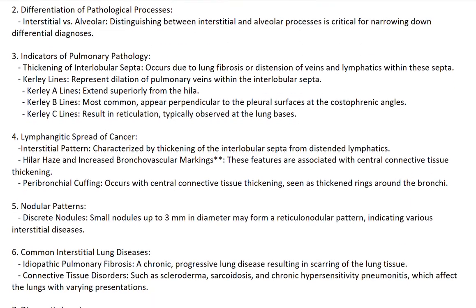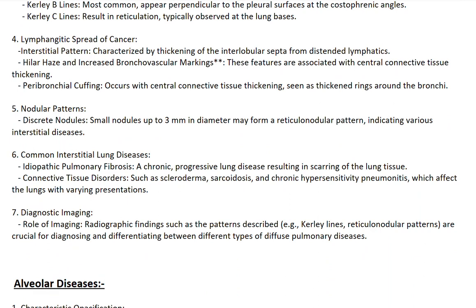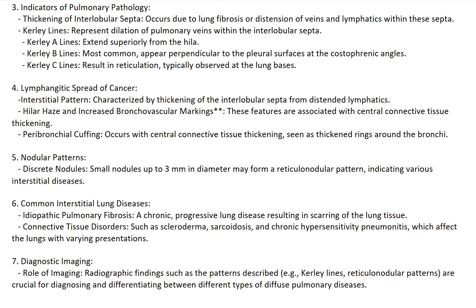5. Nodular patterns. Discrete nodules: small nodules up to 3 millimeters in diameter may form a reticulonodular pattern, indicating various interstitial diseases. 6. Common interstitial lung diseases.